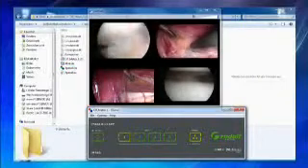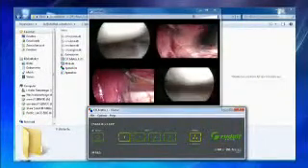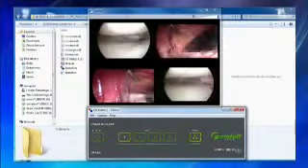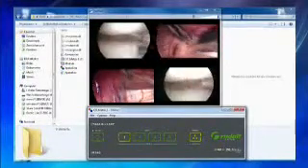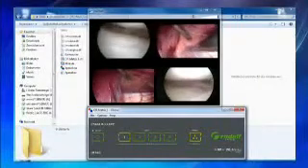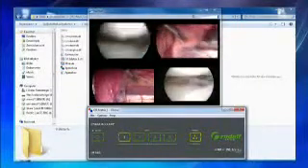It's the ideal component for training, for instance in universities, or for the intra-operational consultation of specialists and chief physicians. They can now, without having to be personally present in the operating theatre, log into the operating theatre directly from their current workplace, for example the head physician's office, or from the outpatient department, get an update of the status of the operation, and provide corresponding recommendations or instructions for the continuation of the operation.